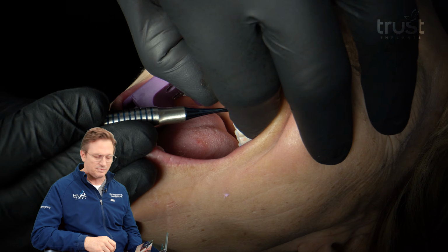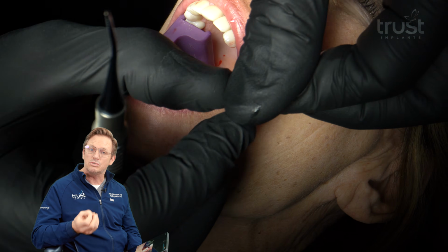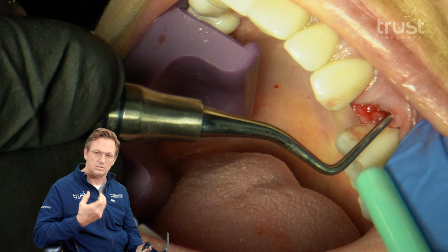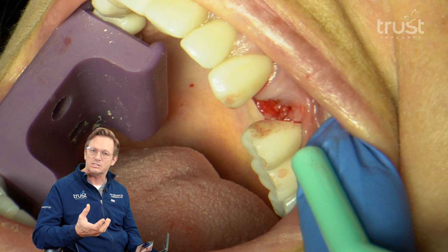And so we can see here where we've elevated the root of the tooth out, and then you degranulate. You take a curette, clean up the alveolus or the extraction site, and then you start the process of preparing your osteotomy, or the hole where the implant goes.